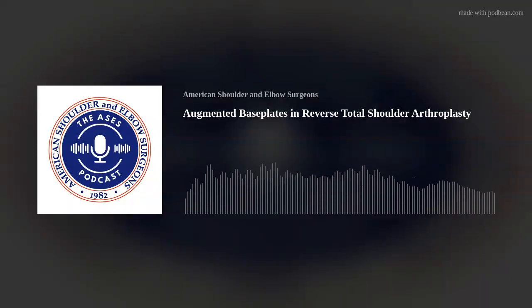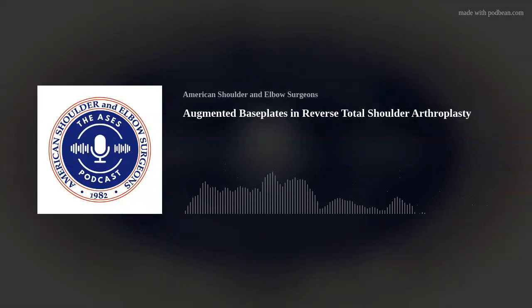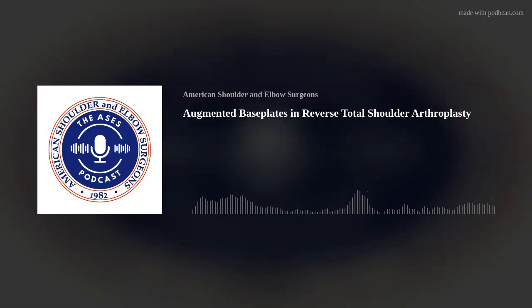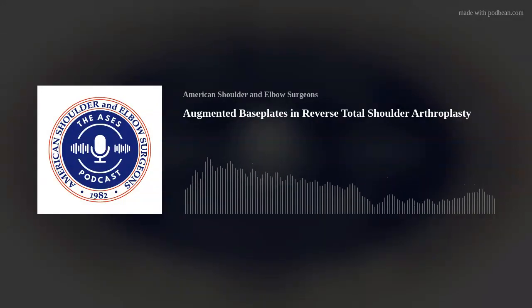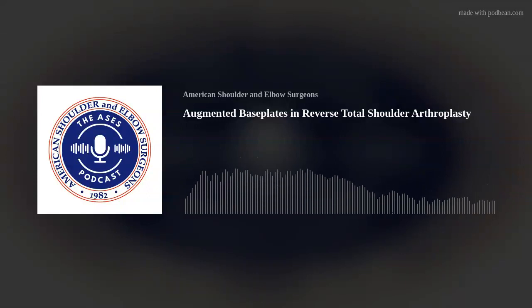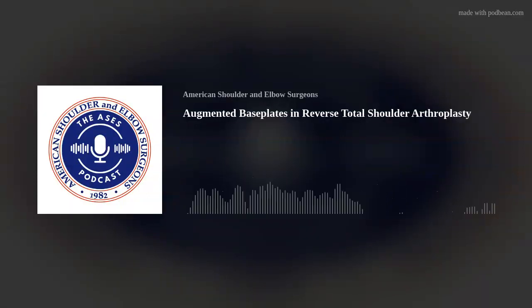Yeah, I absolutely worry about impingement of the conjoint and the anterior portion. I do think, though, that that's very dependent on the geometry of your component. I think that's less likely with a more distalized humerus. So if you're using a traditional Grammont, a 155 where the component is sitting under the glenosphere, I think you have less of that issue than if you're using a 135 where the humeral component is sitting lateral to the glenosphere. Then I think it's easier for you to impinge on the conjoint, and particularly the coracoid.